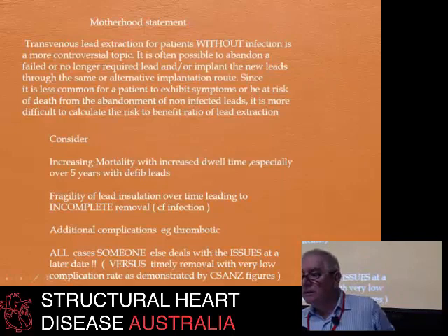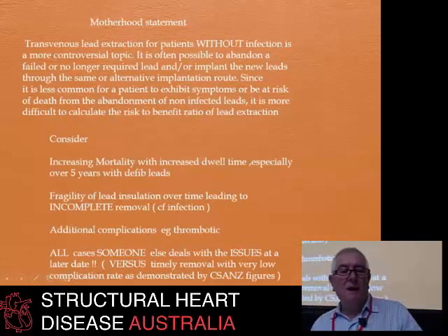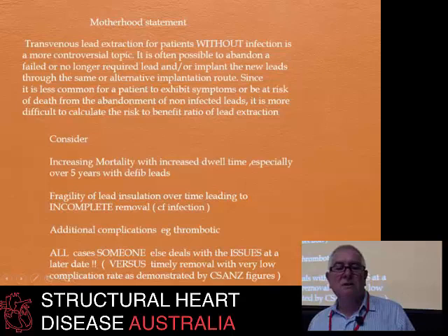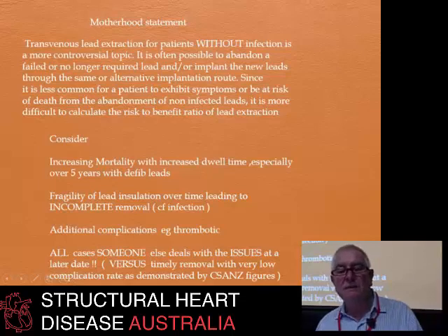When you read through the literature to prepare a talk like this, there are a number of motherhood statements that are made, and there's nothing wrong with them, but they don't take everything into account. So transvenous lead extraction for patients who do not have infection is a controversial topic, and I think that's right. It is often possible to abandon a lead that's no longer required, or to reimplant new leads through the same or an alternative route. Okay, so you're just going to leave the gear you're not using behind.